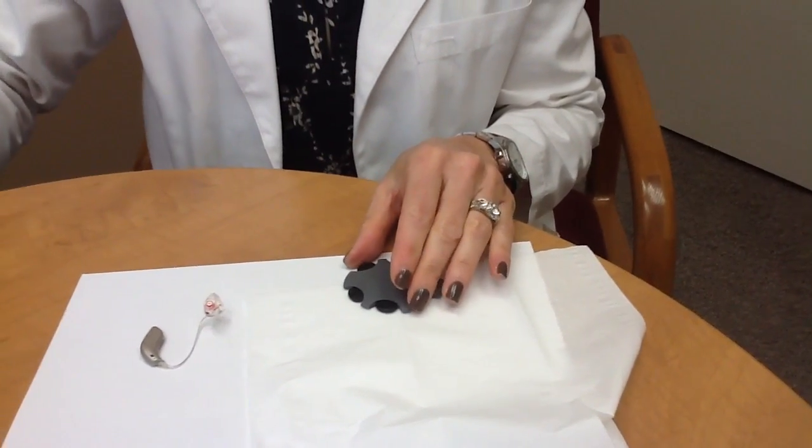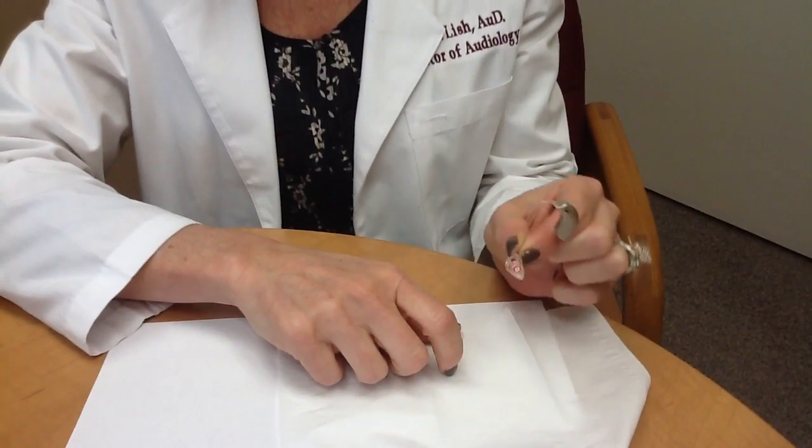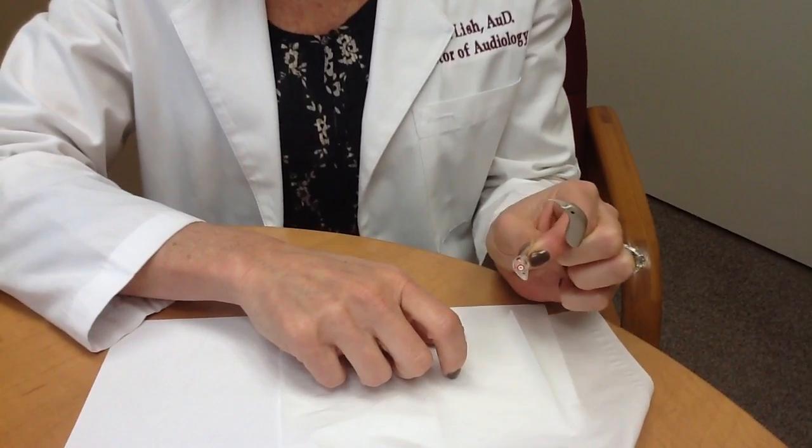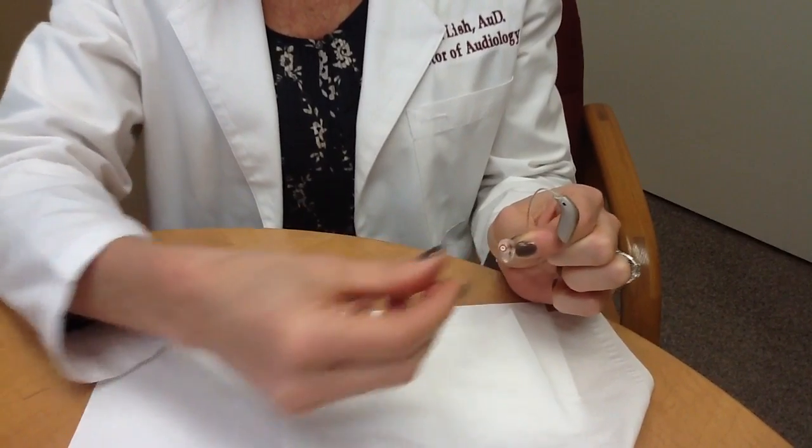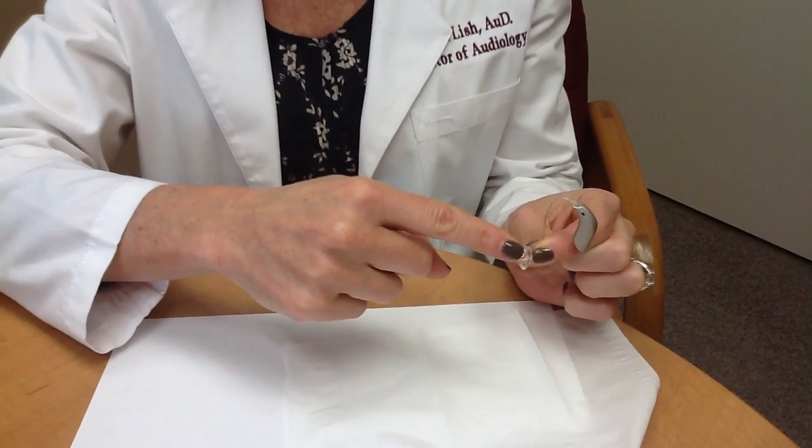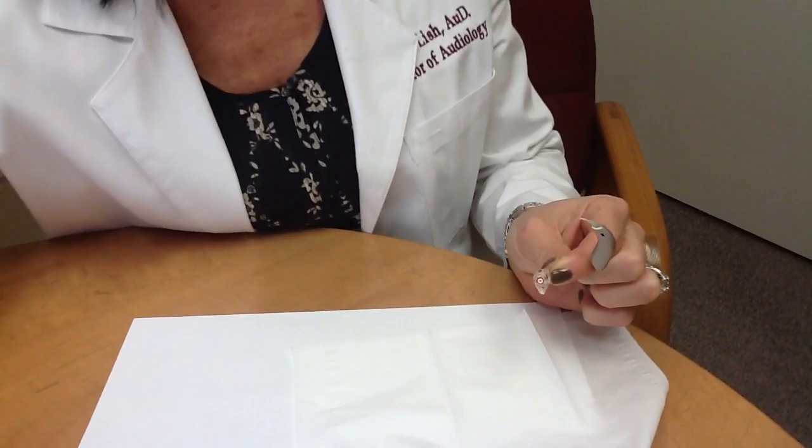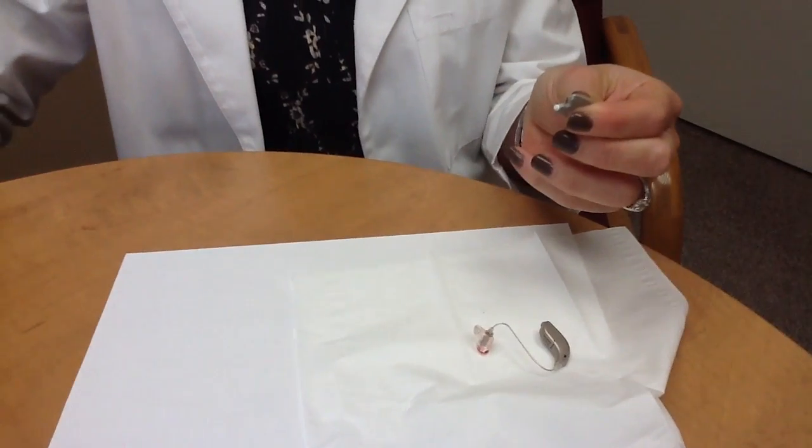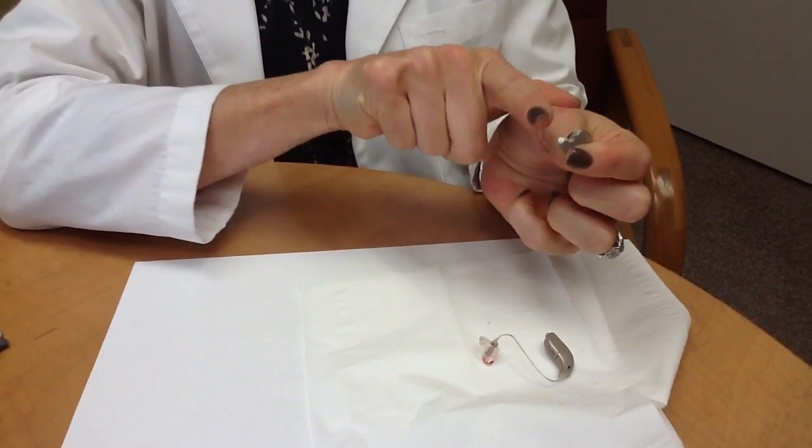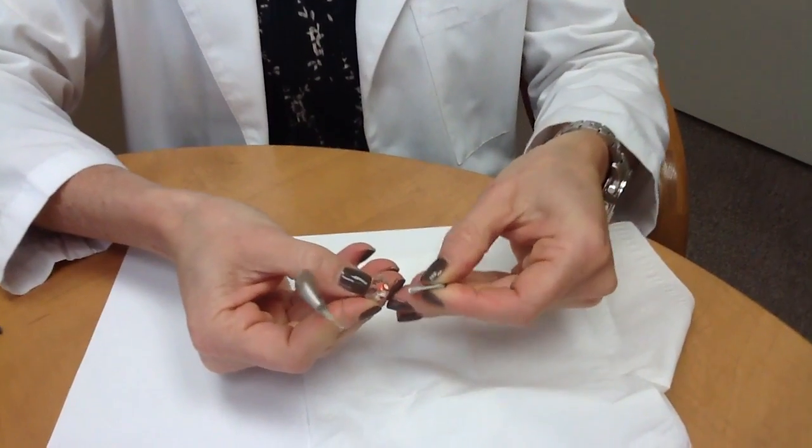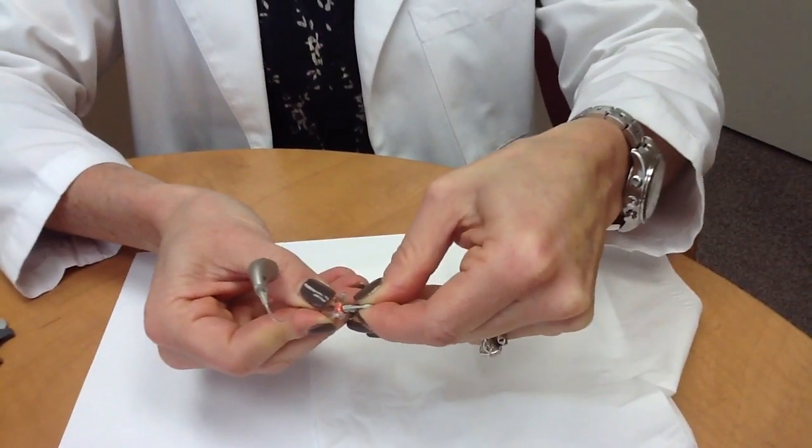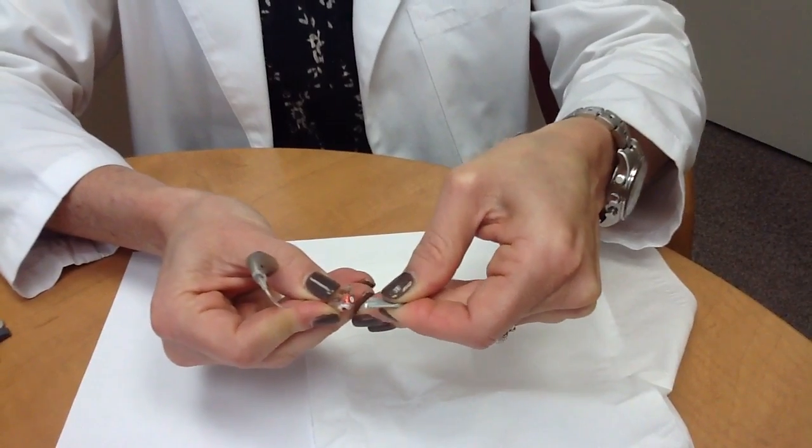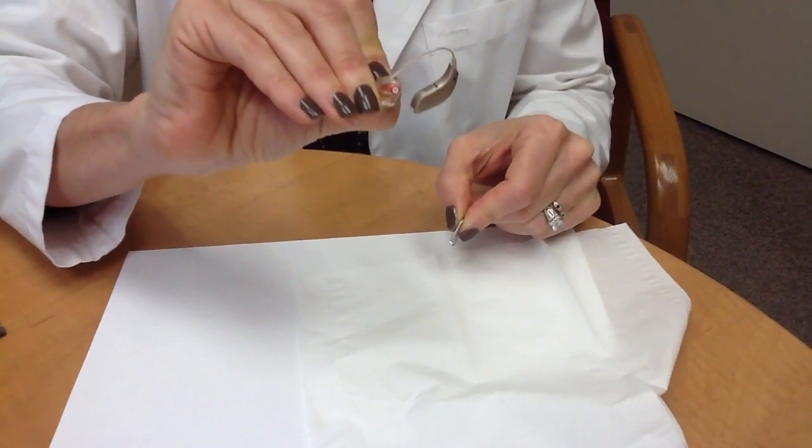The third type I'm going to show you today is how to change the wax guard on a behind-the-ear hearing aid that has an ear mold on the end. It's very similar to the others, except you're not removing the ear mold. You're just changing the tip on the wax guard. This one also has the petal type where you pull this out, you have the removal side and a new one, and you simply push in and pull out, push in and pull out. And now you've just changed it.